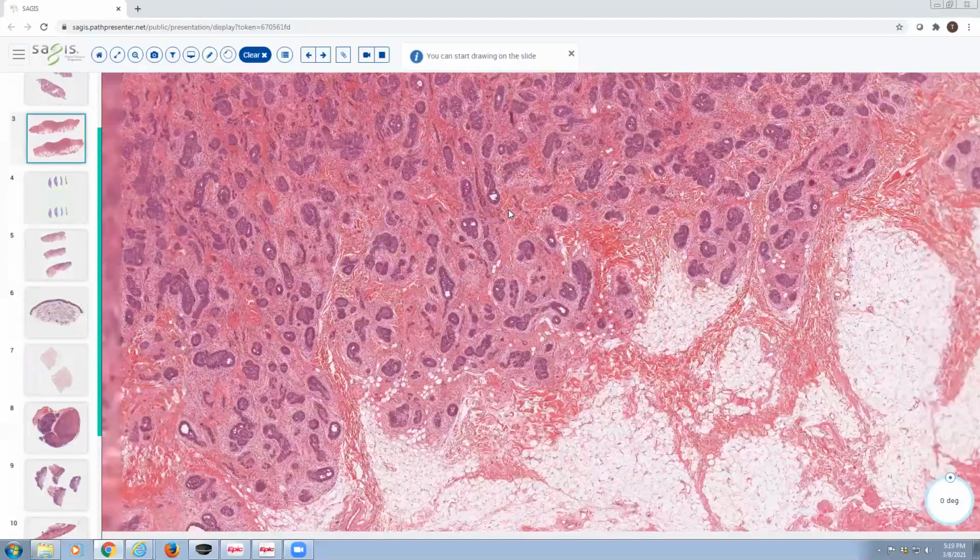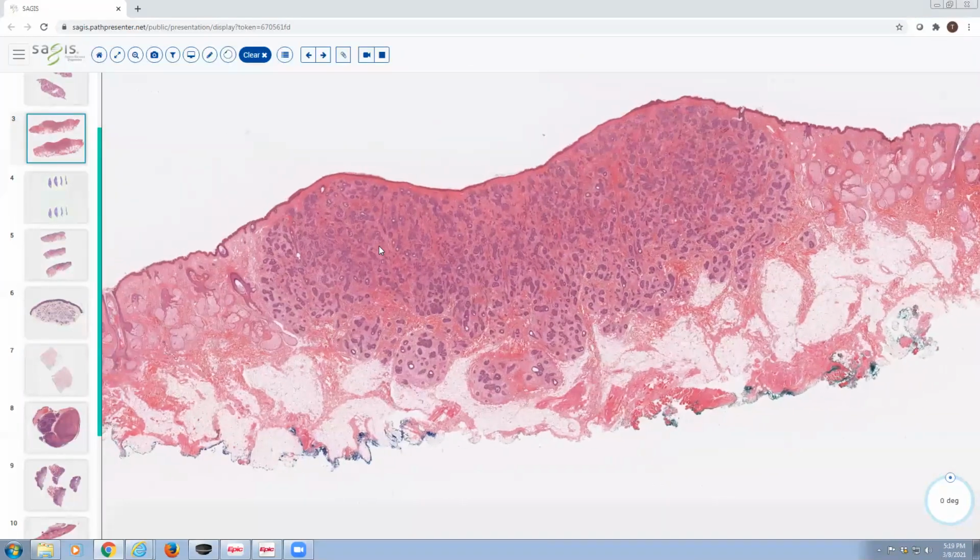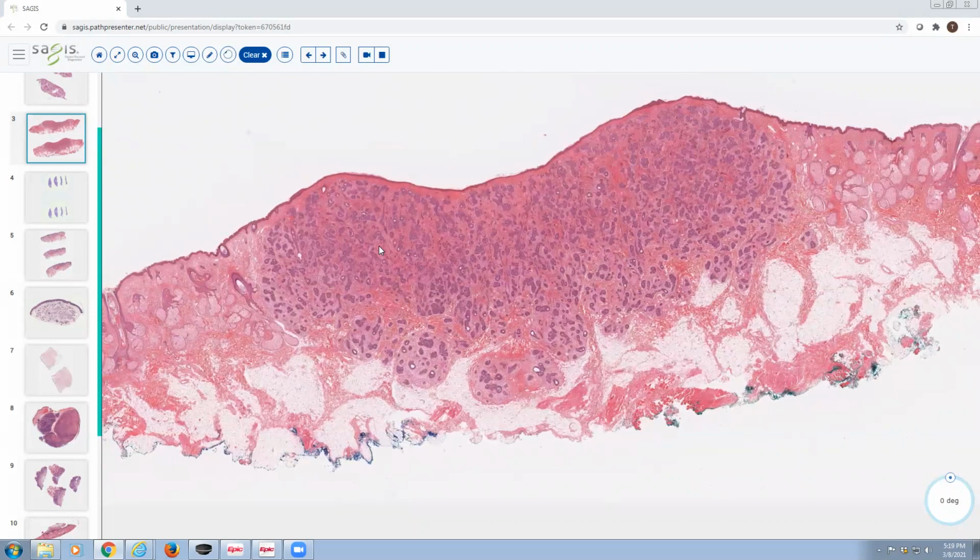So trichoblastoma is a large lesion. It is formed by basaloid epithelial cells arranged in nodules, situated in a cellular and fibrotic stroma. And you will find papillary mesenchymal bodies. So this is a trichoblastoma.